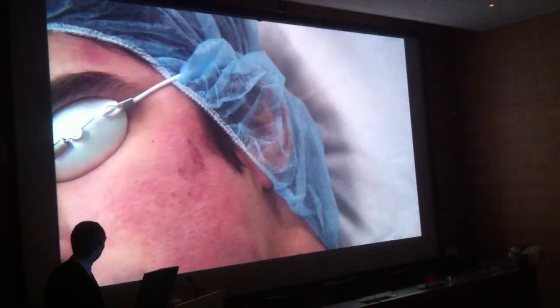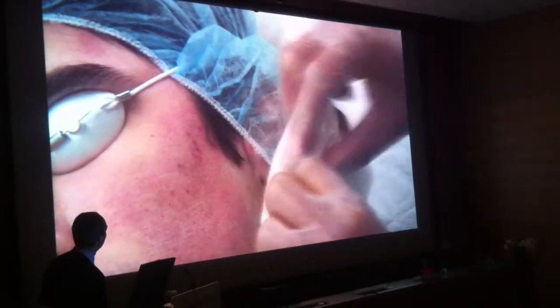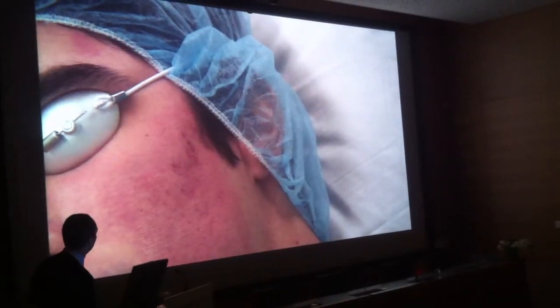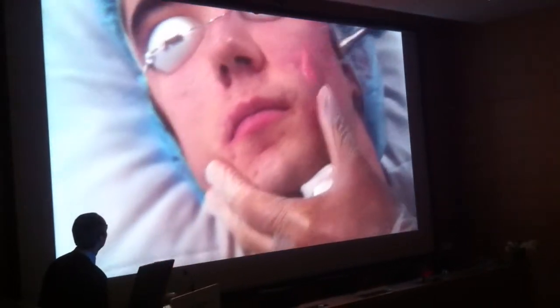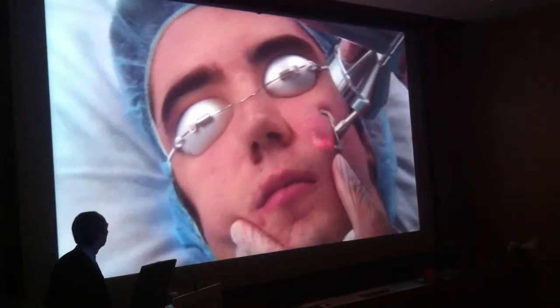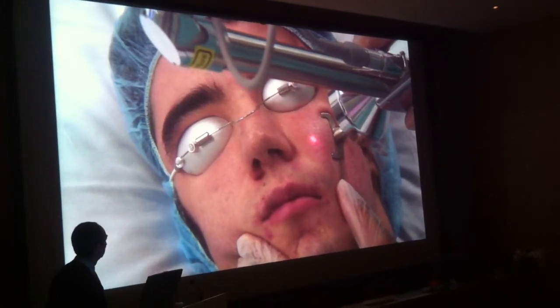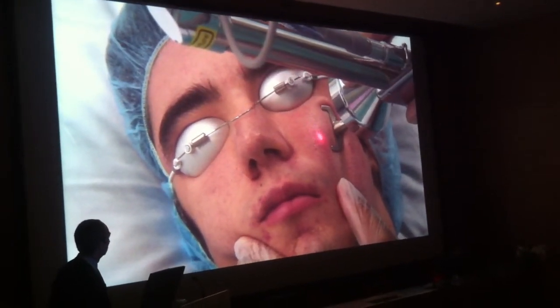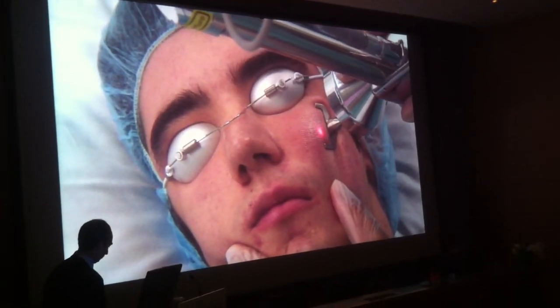This is because here the skin should not be mutilated. I think we should promote more regeneration and look for tightening by improving skin quality, and not just by aggression and removing columns of skin, unlike what other fractional systems do, that have a very small spot and drill holes.